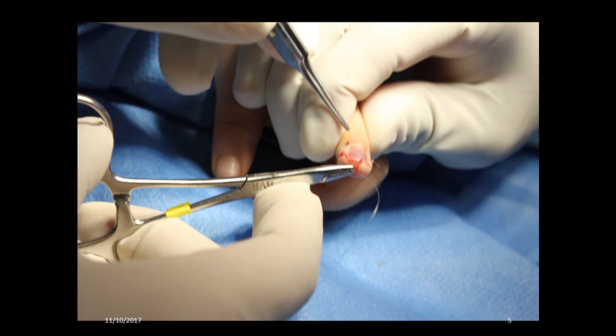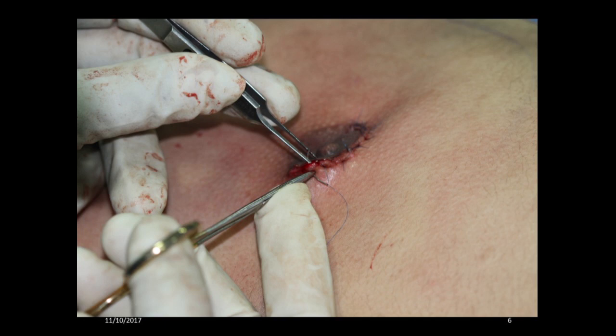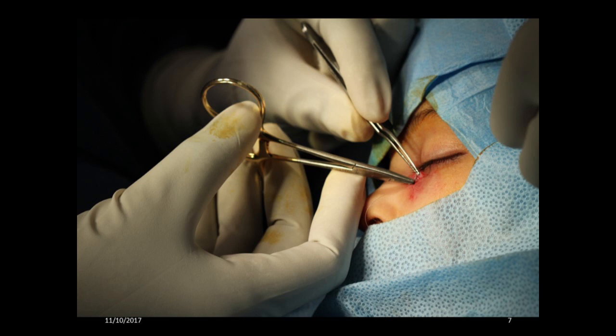This is a case of gynecomastia wound closure. The requirement here is precision control over the suture line to get as invisible a scar as possible. See, the index finger is resting on the body adjacent to the wound, giving excellent support to the needle holder and the suturing process.